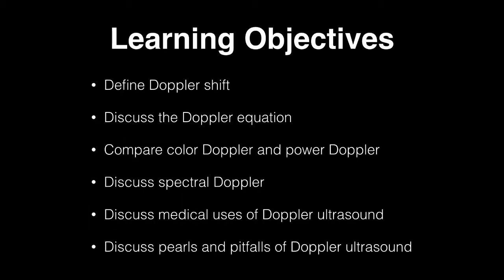In this introductory lecture, we're going to go over the Doppler shift as well as the Doppler equation. We're going to go over the Doppler imaging modes of color Doppler, power Doppler, and spectral Doppler, and we'll discuss the medical uses of each. We'll also discuss the pearls and pitfalls of Doppler ultrasound as well as how to acquire and optimize the Doppler image.